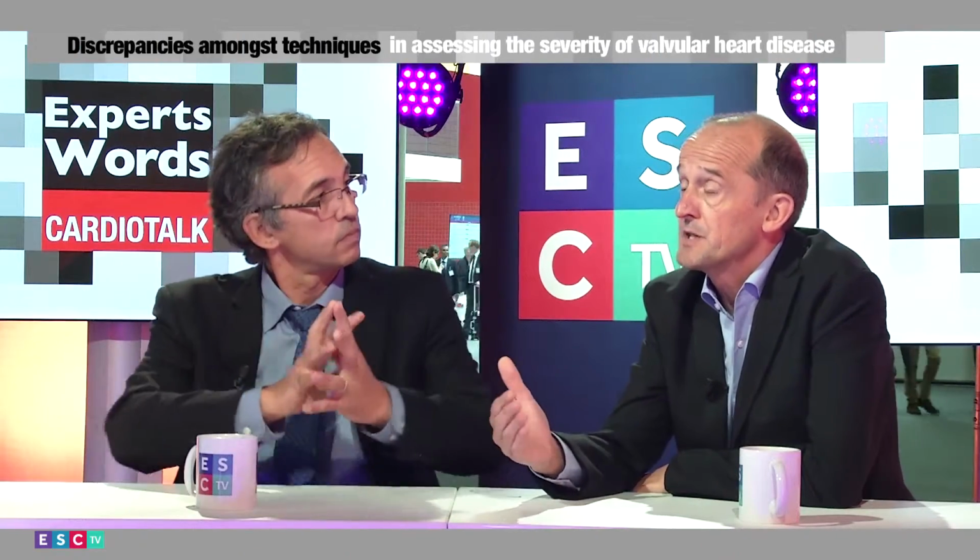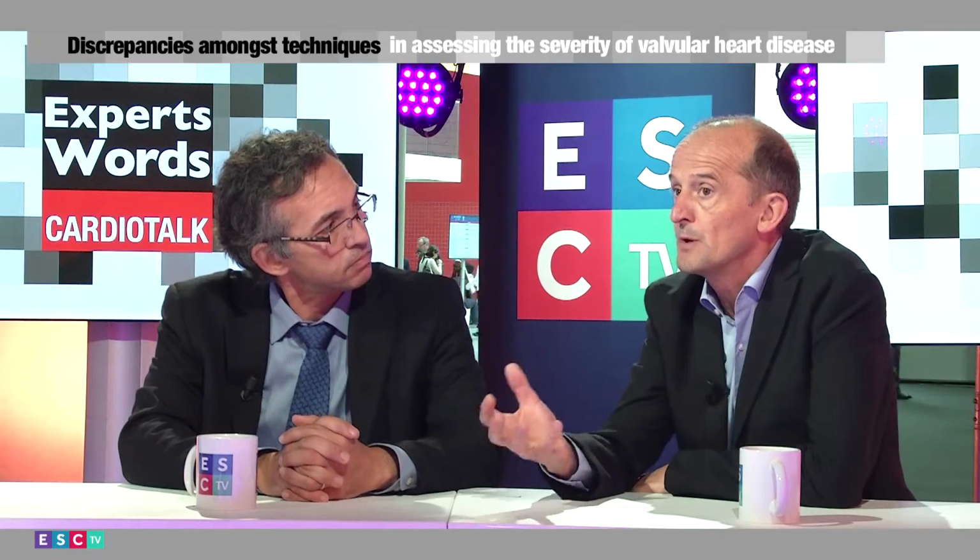And for CMR, maybe, Guy, if you... Yes, I think it's a little bit parallel to aortic stenosis in mitral regurgitation, for example, where it's very important to know exactly what the function of the left ventricle is. If there is subclinical LV dysfunction, you have to detect it. If you are in doubt with your echo tool, just go to CMR. It's an excellent technique also to look for fibrosis. And also there, I think we are ready now to use it in clinical daily practice.